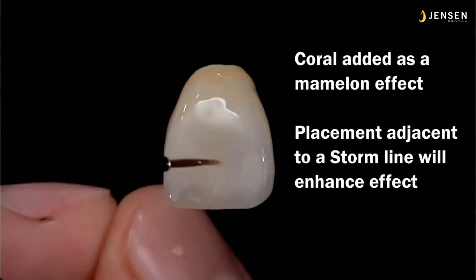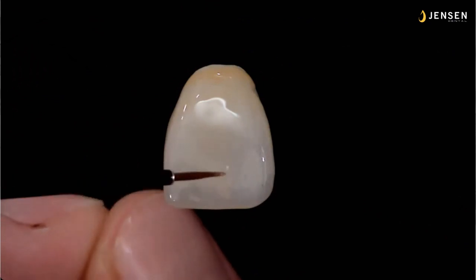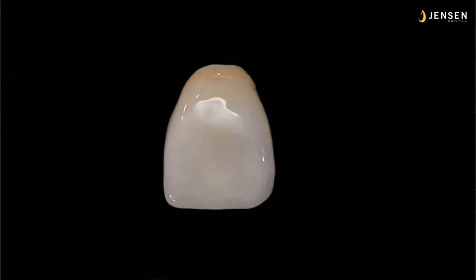And now I'm going to add coral as a mamelon effect, and you want to place it adjacent to the storm vertical line that you put in there because it'll make it pop. You know, it's that contrast between the coral and the storm, the blue and the kind of salmon-y peach color. Just a little bit more enhancement right at the tip.